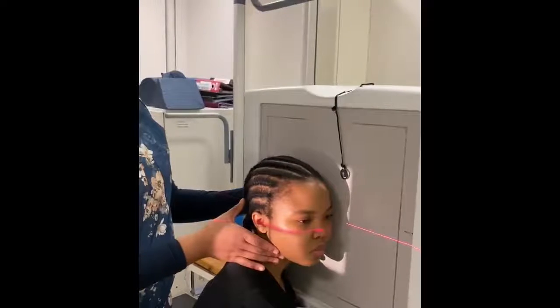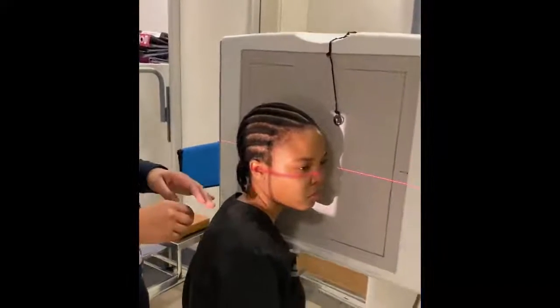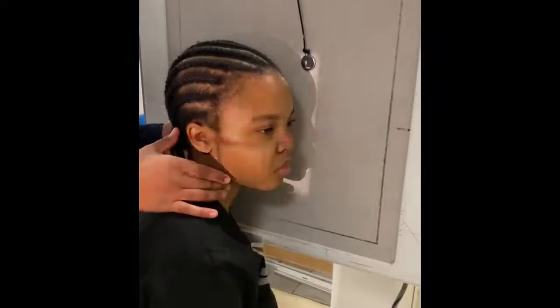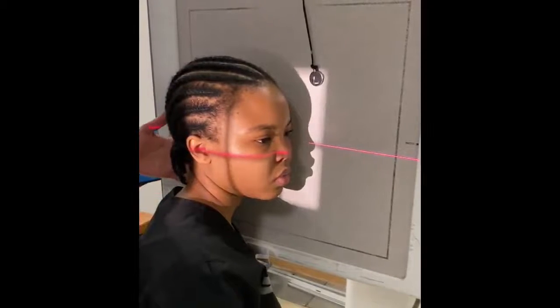In terms of centering, we need to make sure that we are centering at the level of the zygoma or the prominence of the cheek, midway between the outer canthus and the EAM. So I'm going to move my patient slightly back so that it's midway from the outer canthus to the EAM. So around that area at the level of the zygoma.